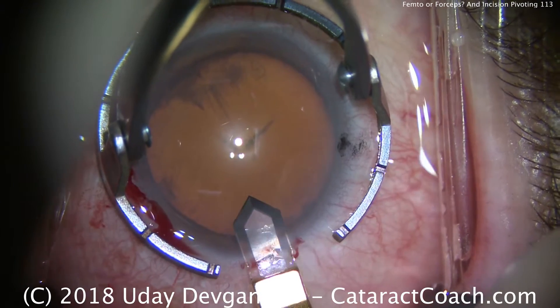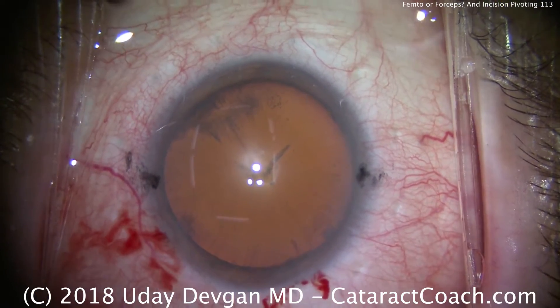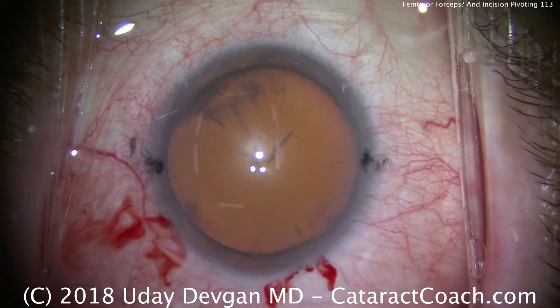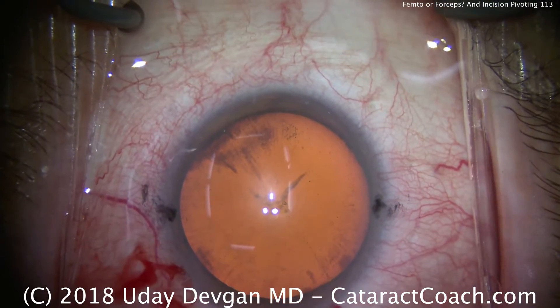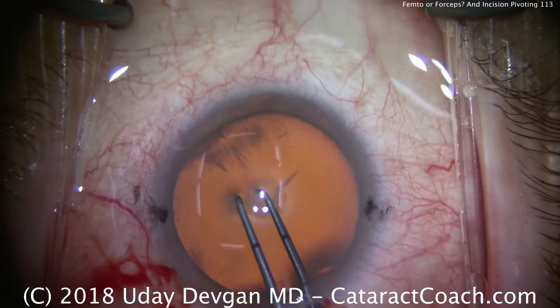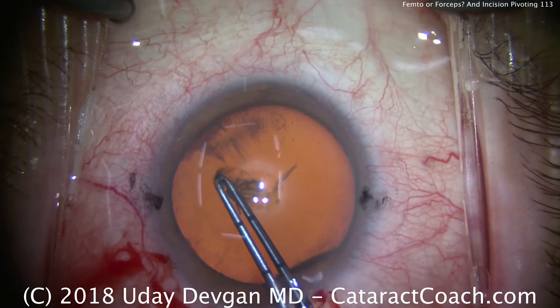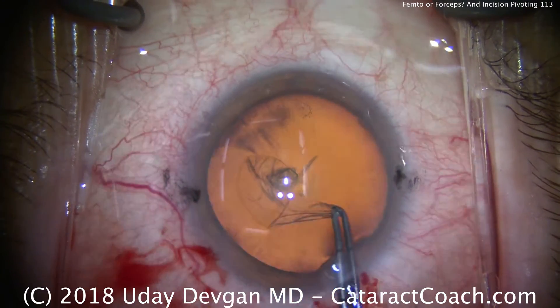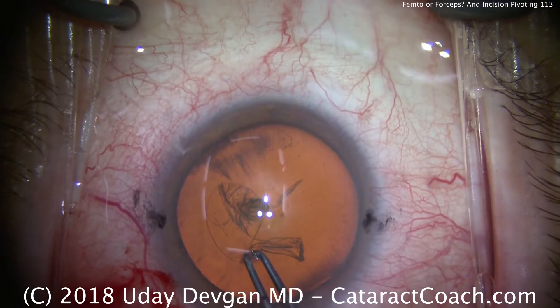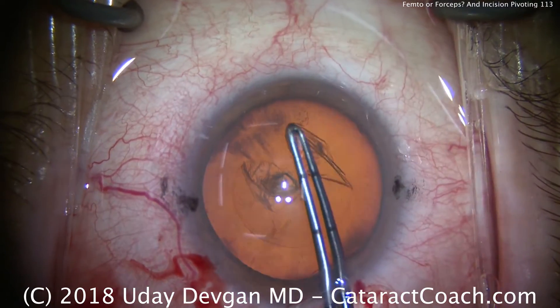We have a lot of working room, and the anterior lens capsule is flat. Now watch carefully — what I want to show you is how we pivot in the incision. The forceps go in the center, poke in and grab the edge of the capsule, but notice how the forceps will pivot in the incision. They'll float in the incision. There's no pushing up against the side of the incision, or the roof, or the floor of the incision.